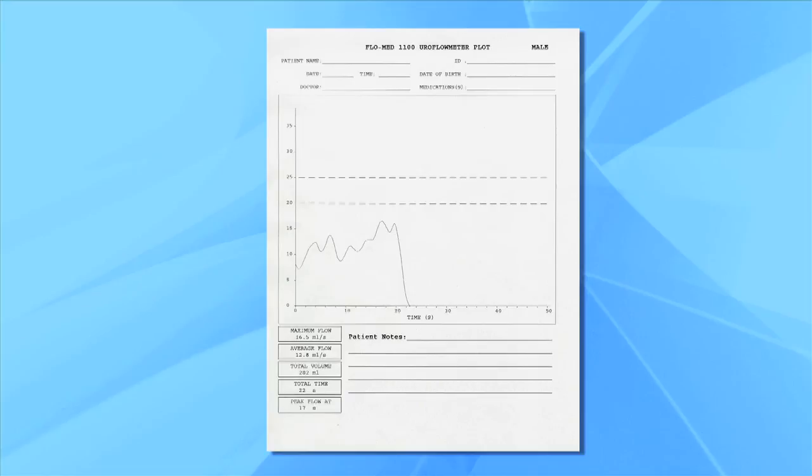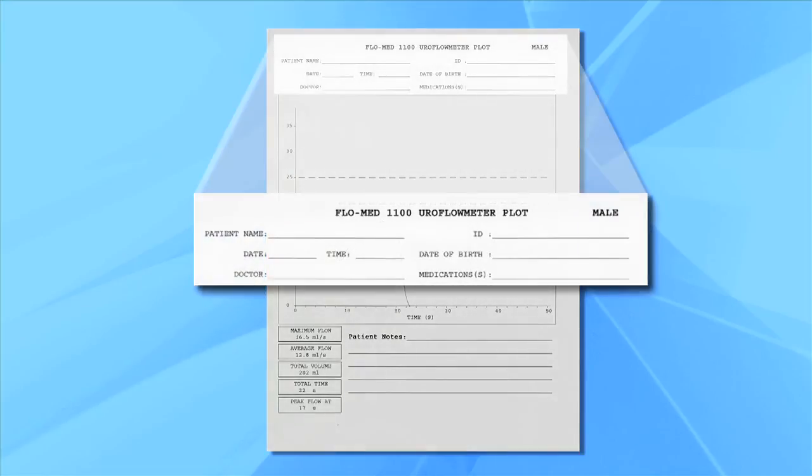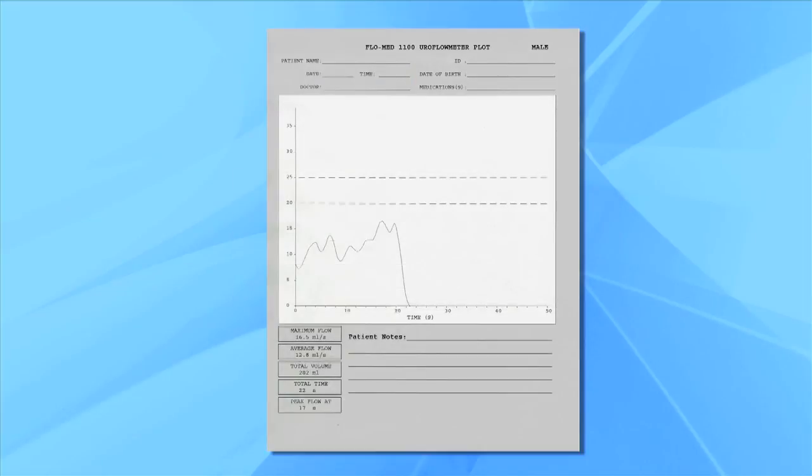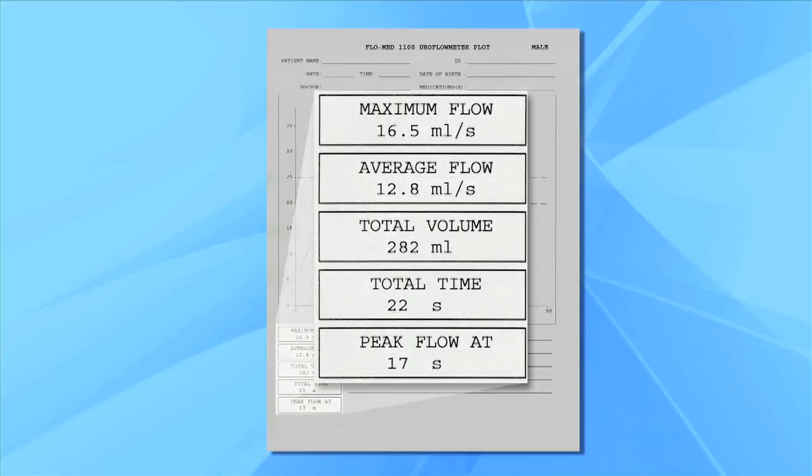The results sheet has areas where the patient and test information can be written or typed, and there is also an area for physician notes. The results sheet provides a flow graph for comparison against the diagnostic range charts. It also produces computed results indicating maximum flow, average flow, total volume, total time, and when the peak flow occurred.